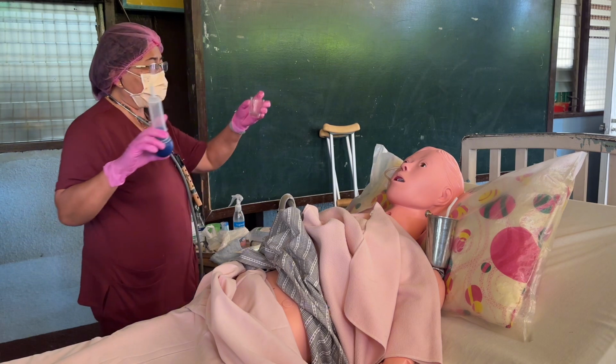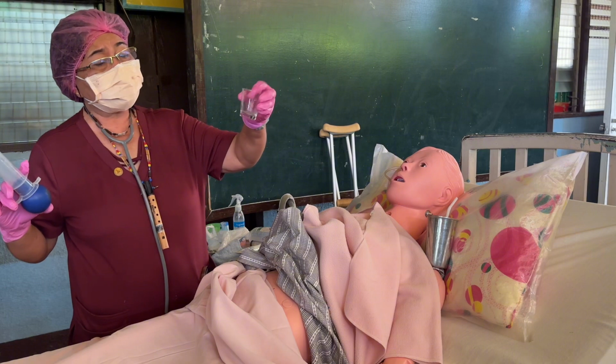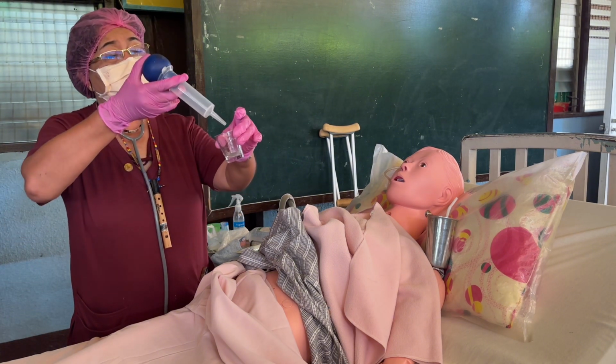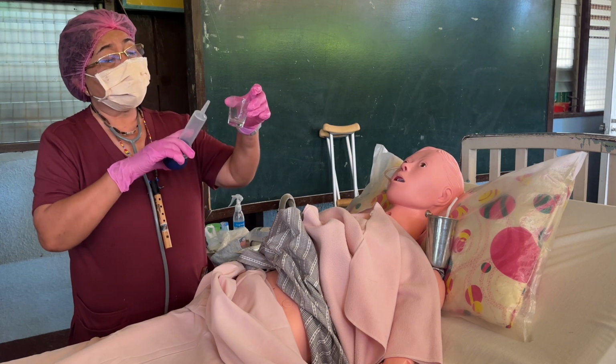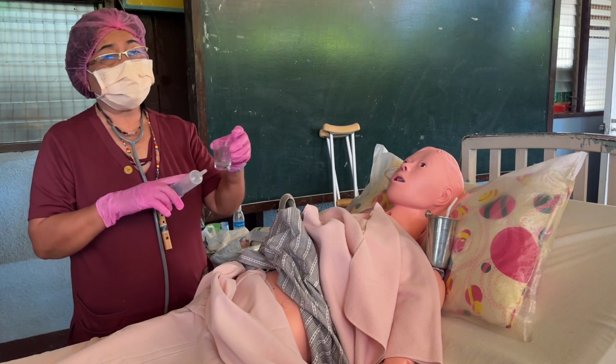So you get now a medicine glass. Then you put the small strips. It is very difficult to buy litmus paper, so pH indicator strips will do. Small strips. And then you mix the gastric juice that you got from the tube. Then once it turns orange, brown, or red, it is an indication that it is from the stomach. Okay?